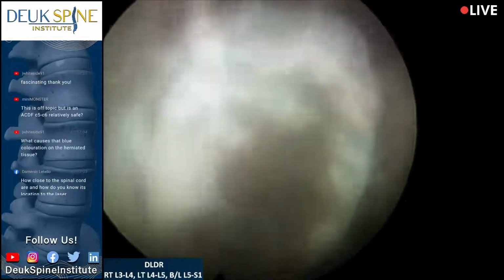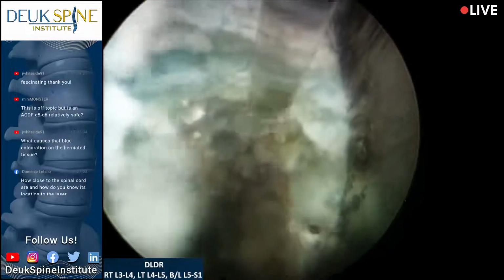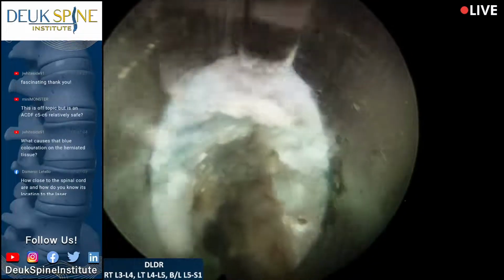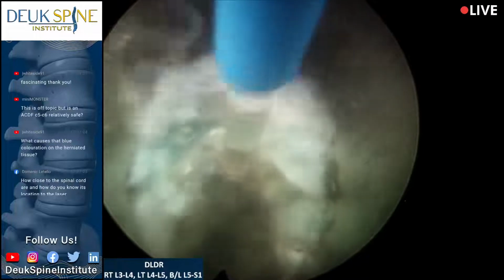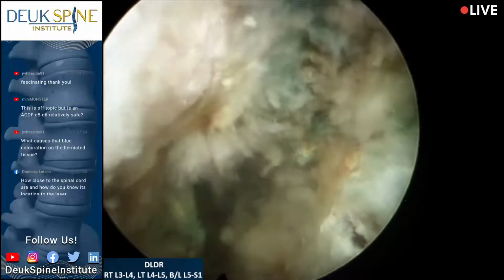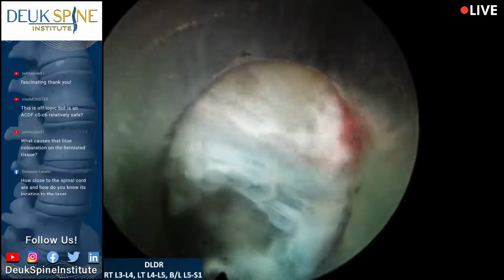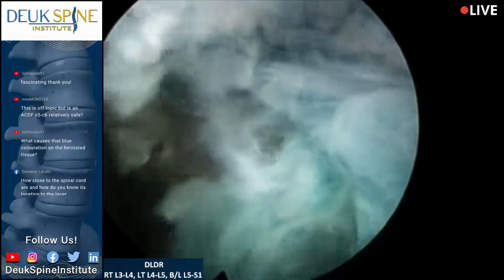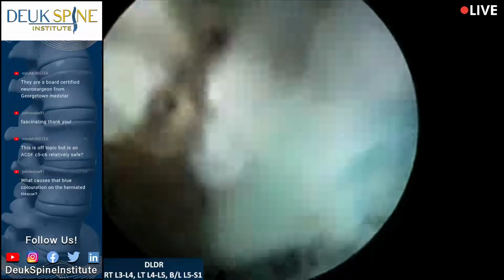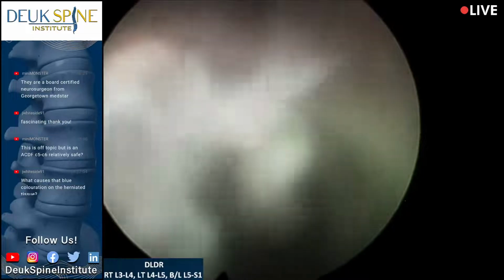All right. Now I really am 30 seconds here. That's got to be it right there. Okay. All right, laser out. So let's take a look at the nerve root. This time it's going to be on this side, and it's kind of buried in there. So we're good distance. Let me have a laser. There's a little bit of disc right here. I want to get it out. It's not enough to cause pressure, but I'm here and I don't want to take any chances. If I can easily get rid of it, I'm going to get rid of it.